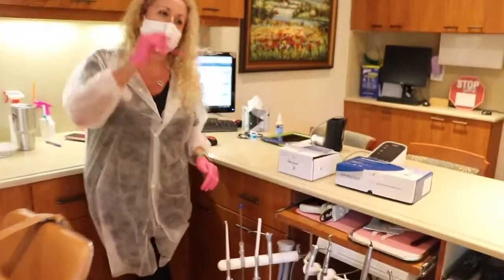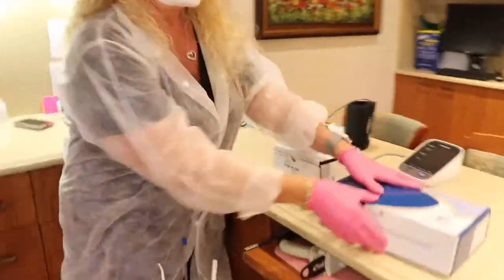I'm super excited. I'm getting my appliances delivered. I have the Herbst Advanced Elite and the Assamonement Avant today. I'm very excited — today is the day. We've been waiting a couple weeks. Okay, Leah, let's start out with the Herbst Advanced Elite.